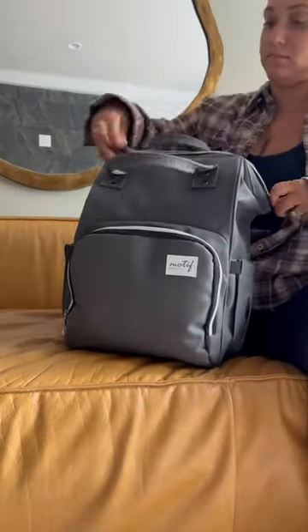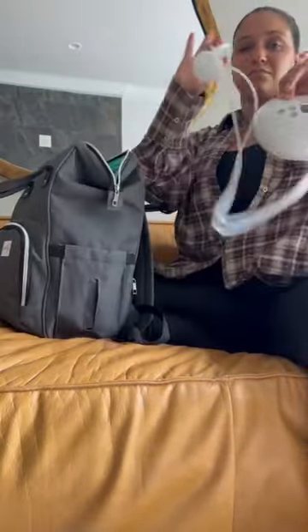Here's what's in my Motif pumping bag. First of all, pump, and today I brought the Lina with me.